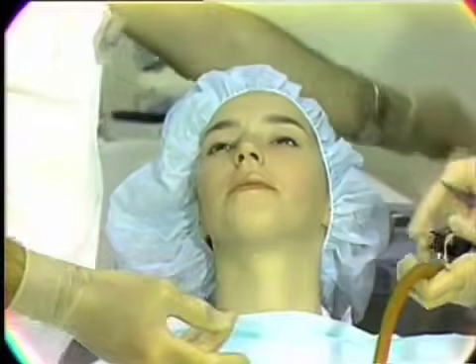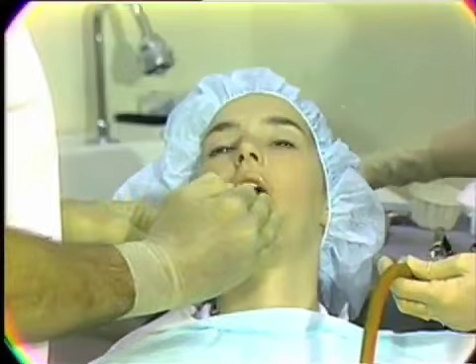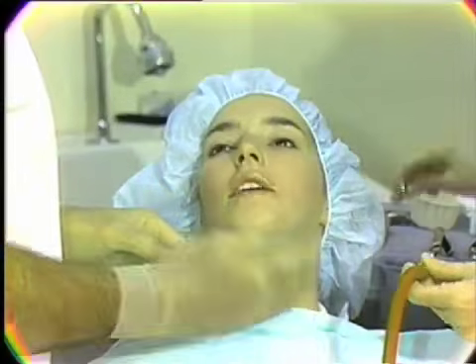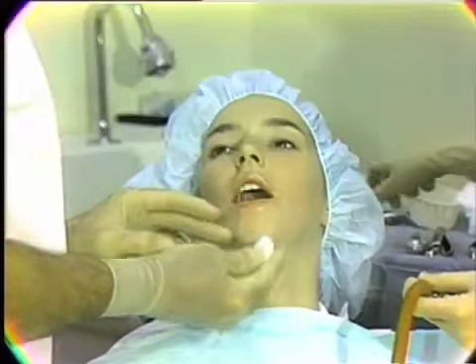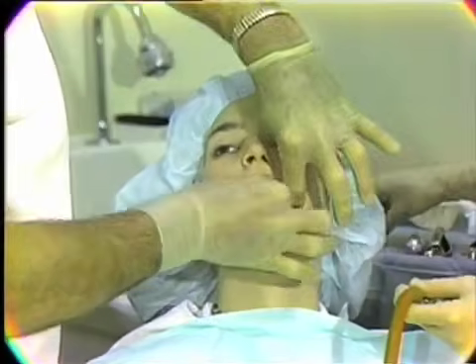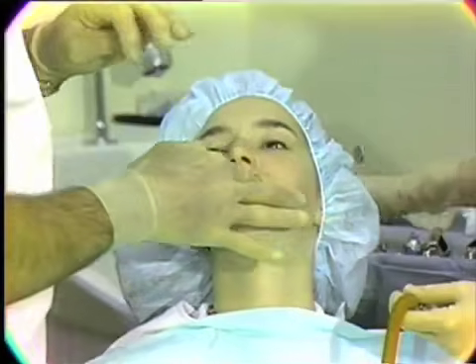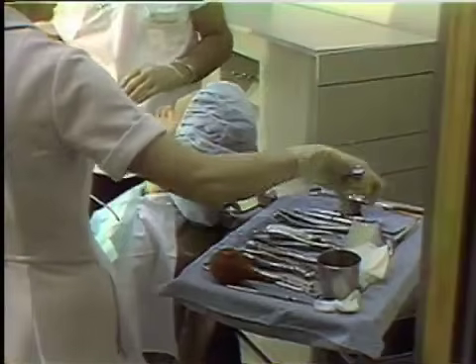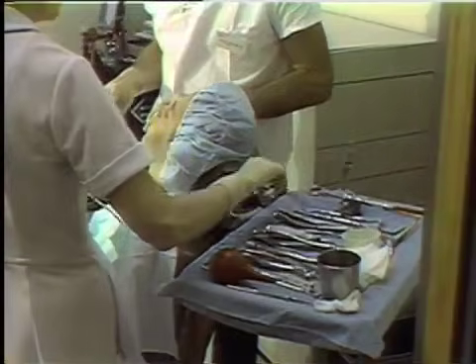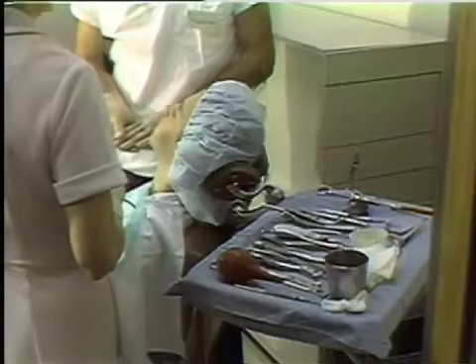Whenever we ask the patient to close, if we have an operative field open, a socket that's open, a flap that's reflected back, we will always take a sponge and ask the patient to close down while we are changing instruments, selecting a new instrument, or in any way involved in a delay from the actual work in that field.